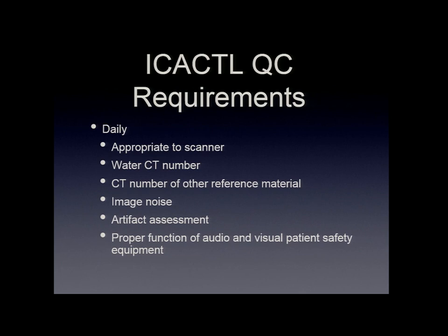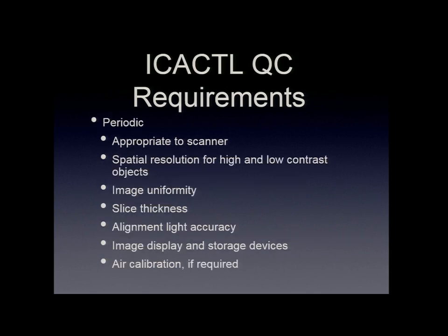indications come up. Artifact assessment is part of the daily QC, and then the proper function of any audio and visual and patient safety equipment is also needed, just to make sure that you can see your patient while you're scanning them and be able to communicate with them to keep them from moving, or in case there's some issues so they don't get injured during the scan.